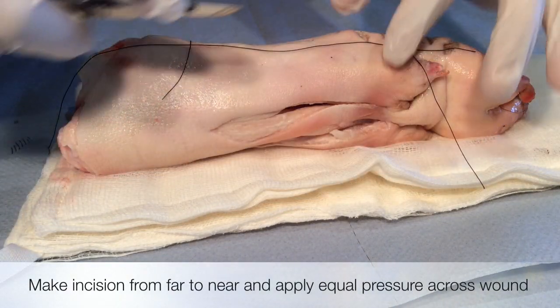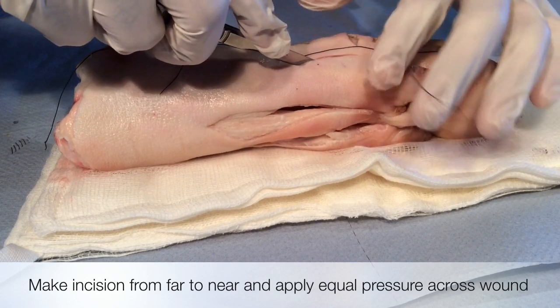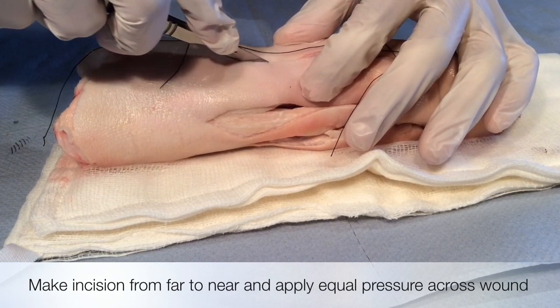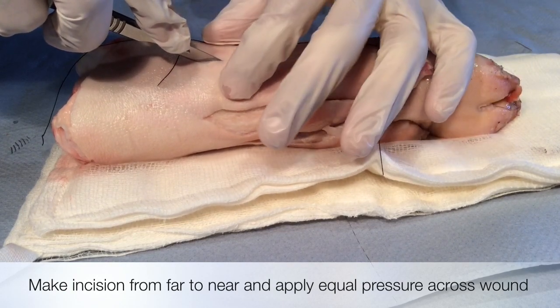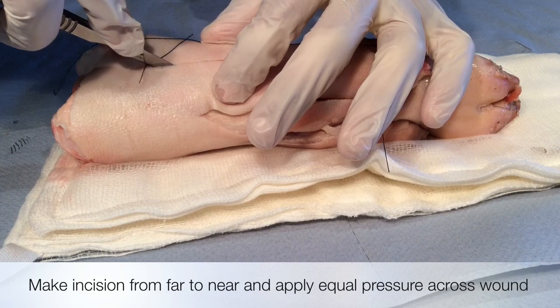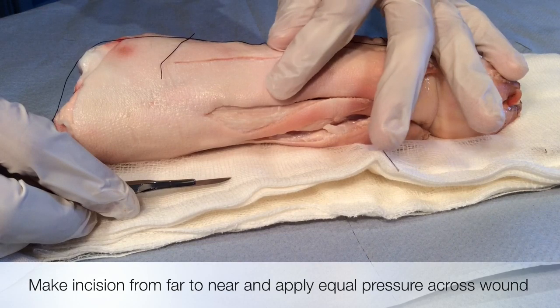When making the incision, slide the scalpel smoothly and with equal pressure towards you. Never lift the scalpel from the wound until your incision is complete. As you can see in the video, this allows for equal depth of incision.